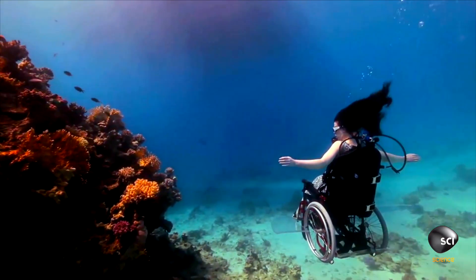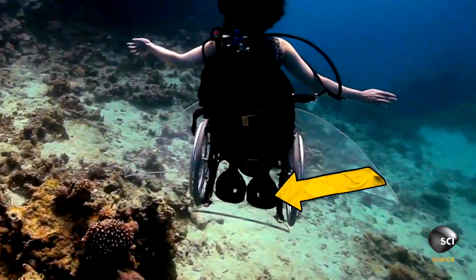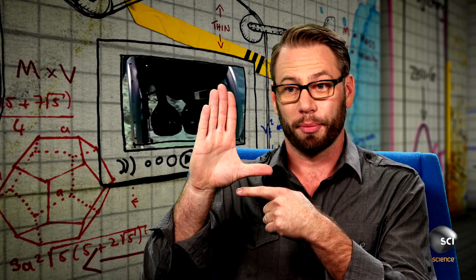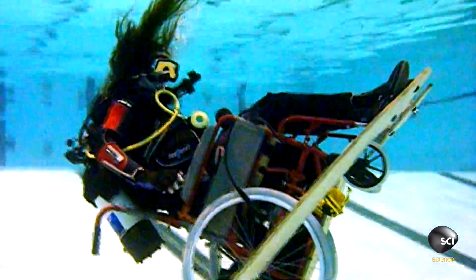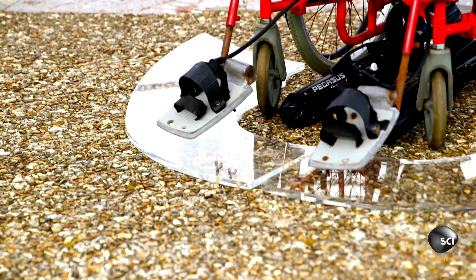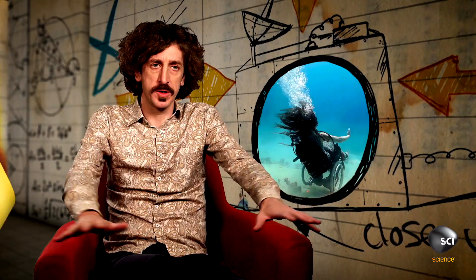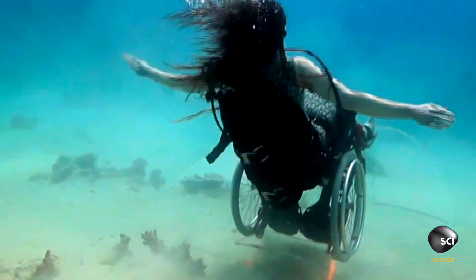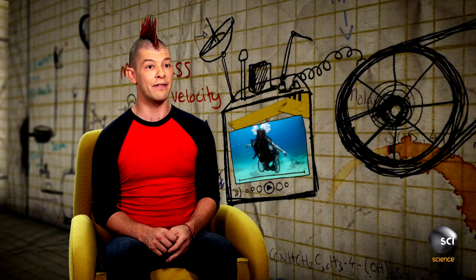How does Sue move forward through the water? Sue needs to move through three-dimensional space. To do this she has an electric propulsion system to drive her forwards, but this system is mounted at the bottom of the wheelchair. It means it wants to pull the bottom of the wheelchair forward while the top has the drag of the water acting on it — combined, this will cause the wheelchair to tilt backwards. To stop this spin she's attached two large foot plates like fins over the front of the wheelchair, and this stops the front from rising. Not only do these plates keep her stable in the water but they also make it possible for her to navigate.